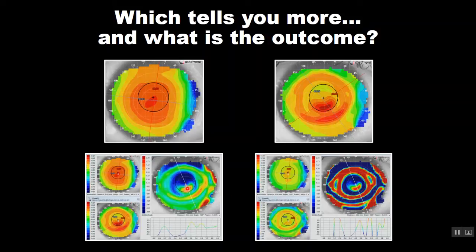Well, this patient had a little bit of grade 1.5 central corneal staining after one night, and that produced a disruption in the epithelium. So we got a disruption in the ring reflection. We got a false central island. So the call here would be to ensure that this cornea responds well within half an hour or an hour of post-treatment, that the epithelium recovers quickly. Then I would put them back in the same lens if the cornea is clear and ensure that we get the bullseye. So go more nights, because this is most likely not a central island. It might end up as a smiley face.